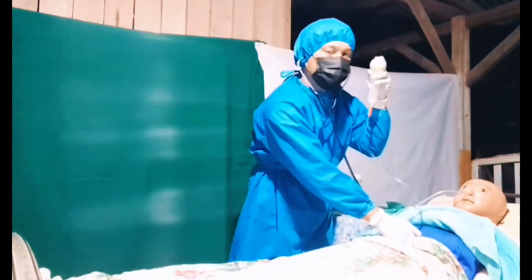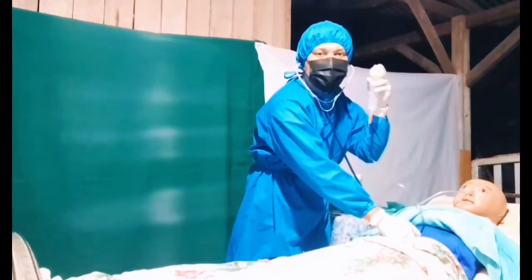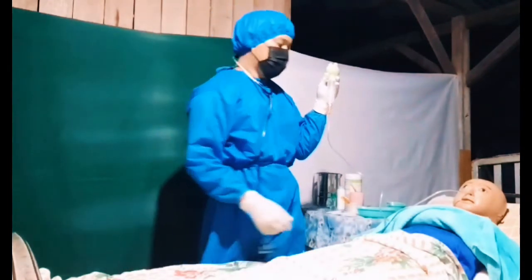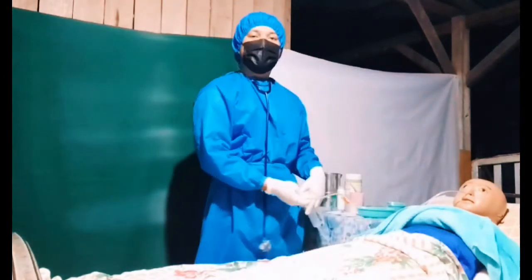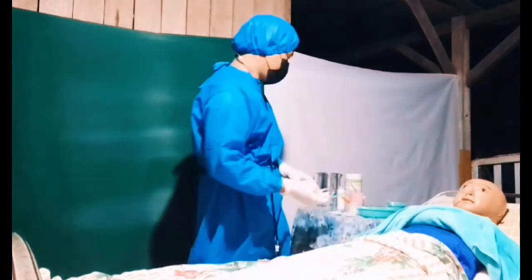Listen for a gurgling sound. If you hear that gurgling sound, that means that the tube is in the stomach. Another procedure in checking the placement of the tube is the gastric content. Test it on the litmus paper. It will turn red and that indicates that it is good.